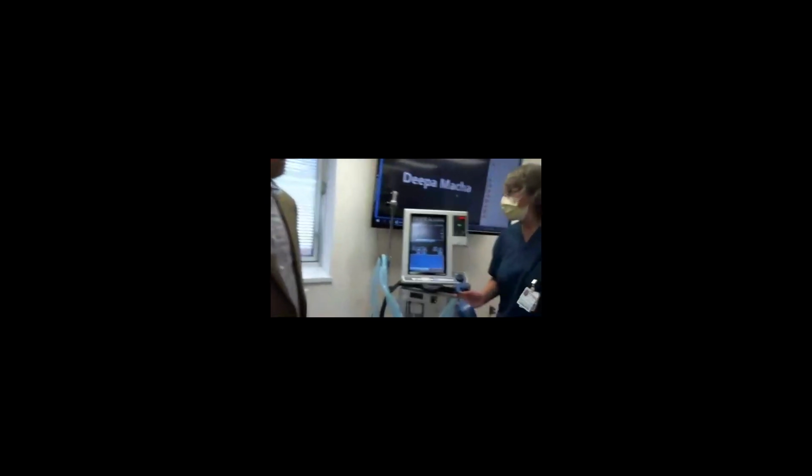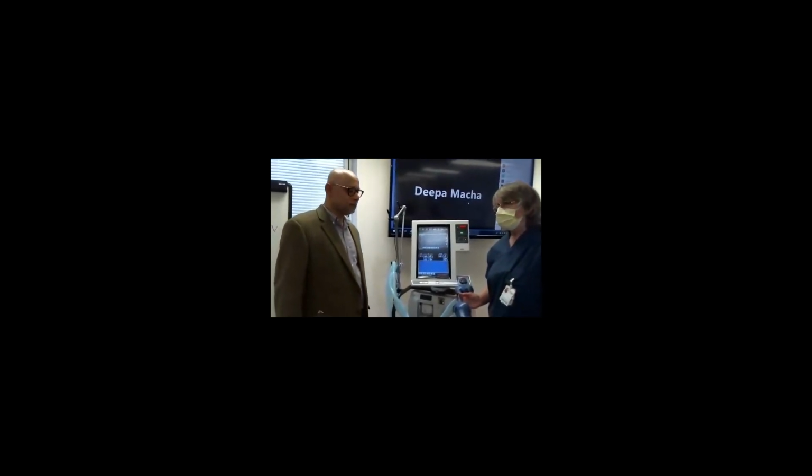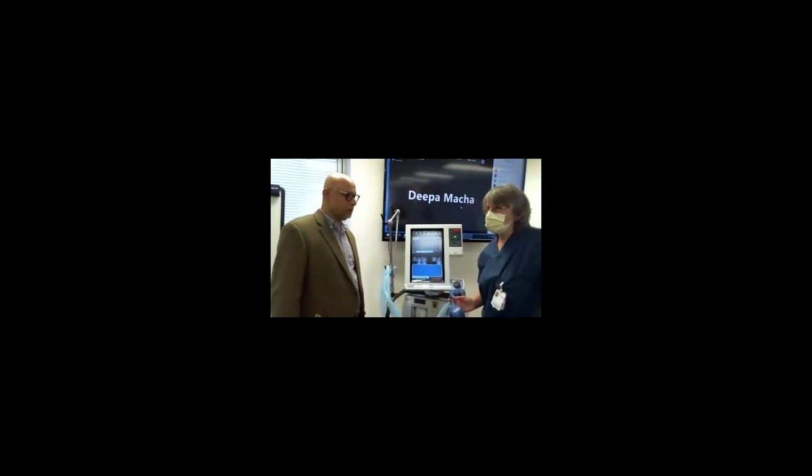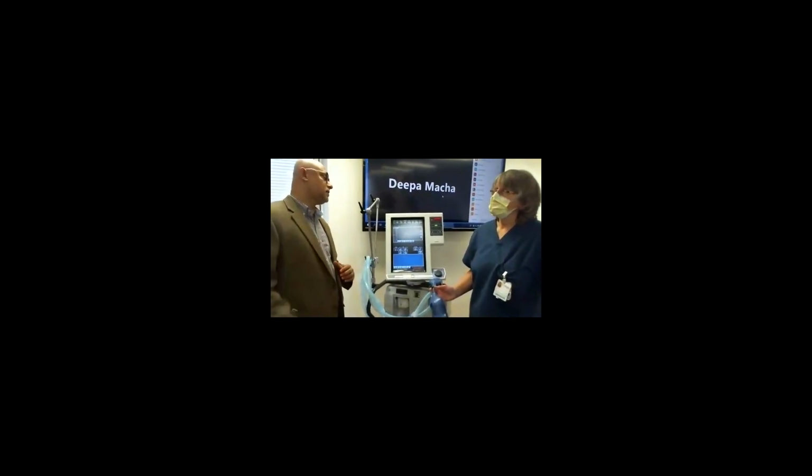And this is in volume control. Yes, exactly. And we would check a blood gas within the hour to make sure that those settings are adequate and make any adjustments according to the blood gas. If the PCO2 is high, we would increase the rate and/or the tidal volume as long as the peak airway pressures are okay. If we're overventilating, if they're alkalotic, we would turn down the rate. Let's start with this initial, wait for the ABG, then we'll decide further changes.